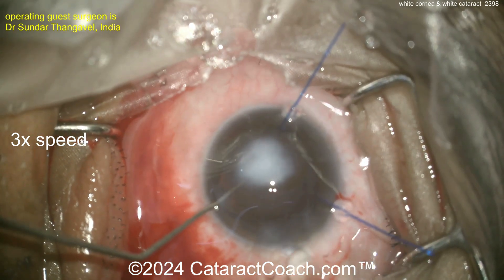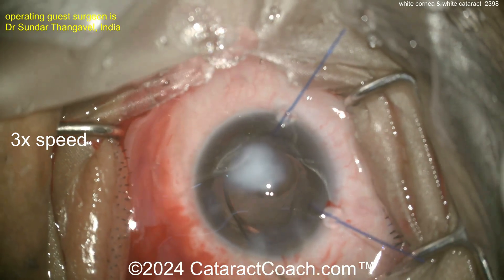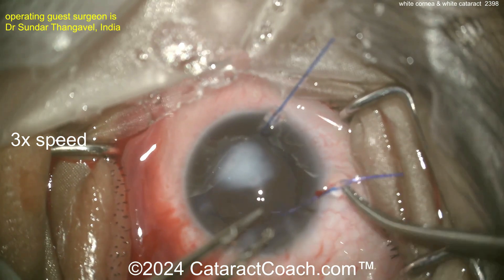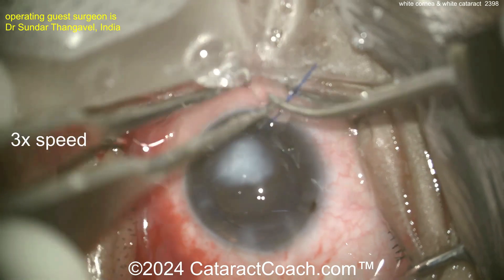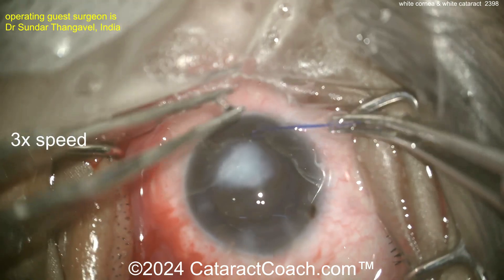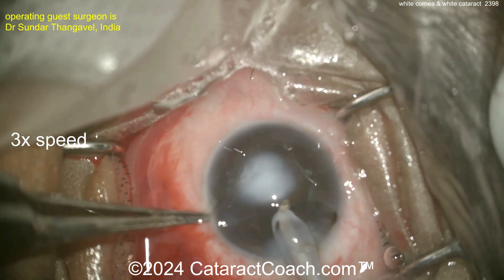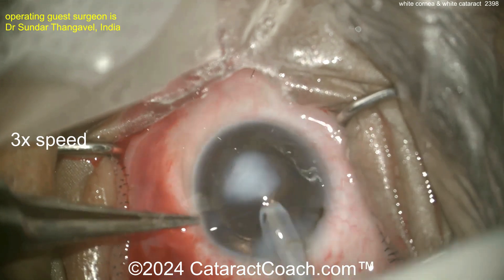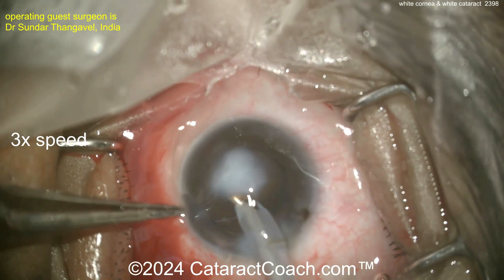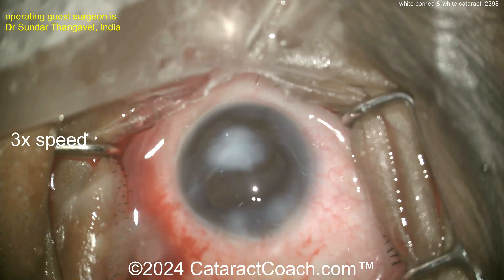Clean up the capsule bag — looks like a little bit of a capsule extension, but that's okay. Once the bag's cleaned up, putting the lens in the bag. How do you do the lens calculations? You can estimate — use the other eye, add a little for myopia, and check the central three millimeter corneal power of this eye. Use the lowest K values in that central three millimeters, because it's okay for the patient to end up a little myopic. With a big leukoma like this, the patient isn't exactly concerned with hitting the exact refractive outcome. This is a far better result than before surgery where the patient had no useful vision. Taking out the viscoelastic and finishing up — the patient could be thrilled. If that's the case, you're done. If not, you can always go back and do a corneal transplant later.